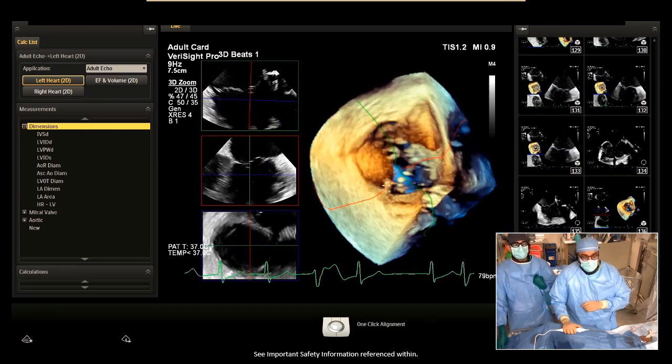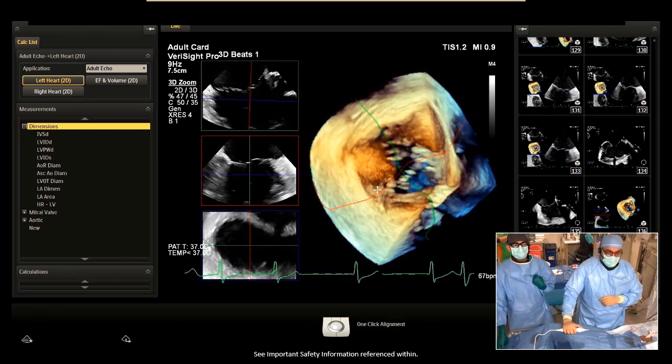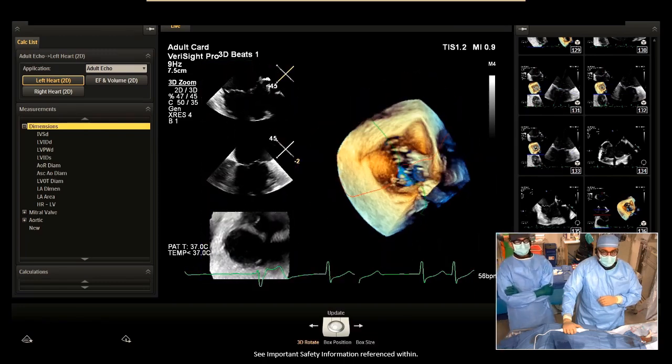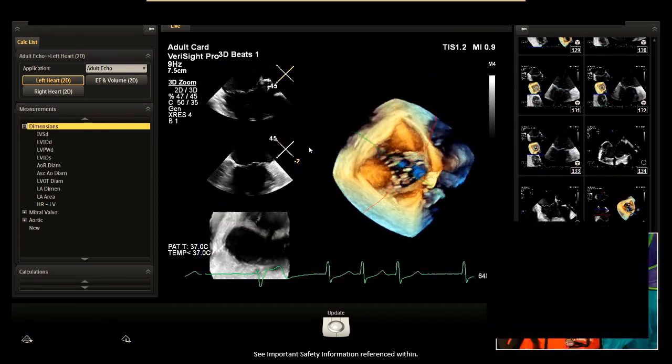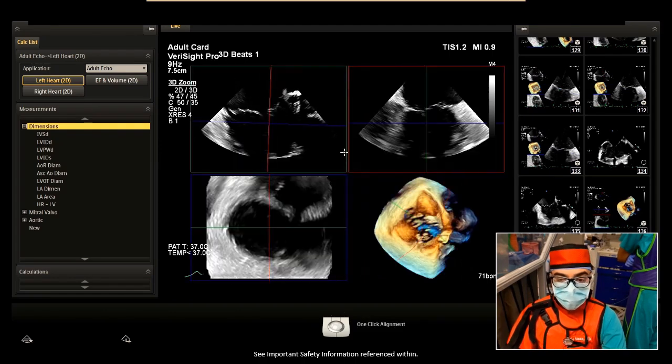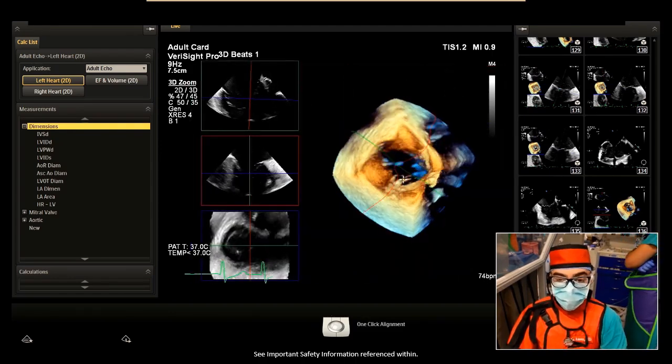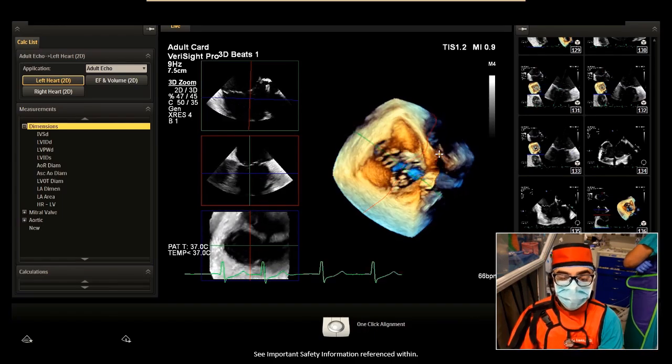So Edris, do you want to take us straight to an X-plane view now? Mm-hmm. So what I can do here is you can see here the 45 degrees in this middle portion, Gagan, like you talked about. That correlates with this red plane here. Excellent. Right? So now I'll go straight to a 45 degree if you like, Gagan. Yep. Okay.